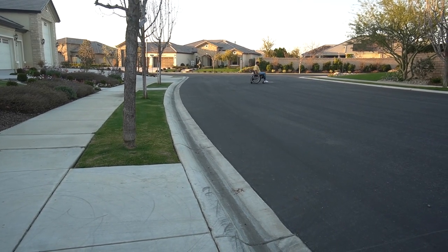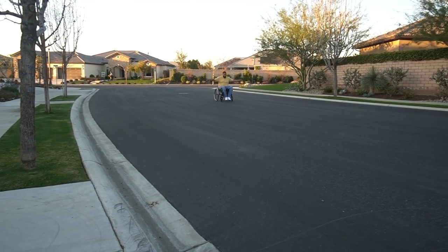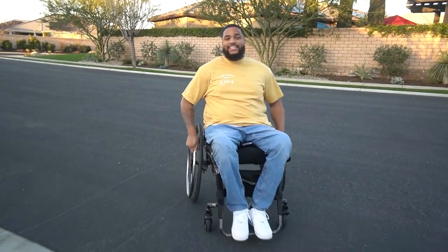Whoa. This thing is fast. Watch out. Today we're going to be reviewing the Smooth 1.